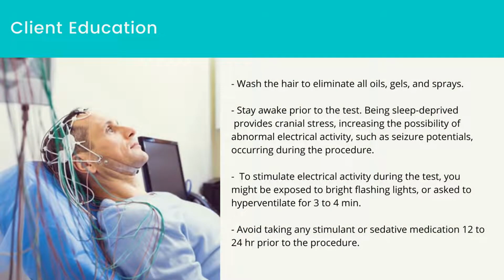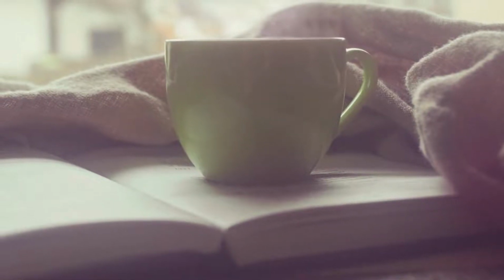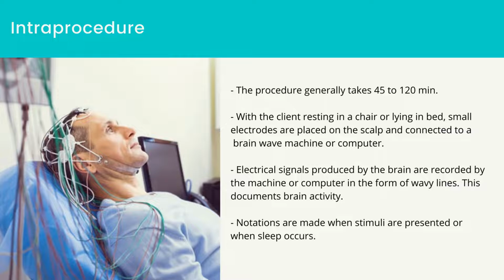Being sleep deprived provides cranial stress, increasing the possibility of abnormal electrical activity, such as seizure potentials, occurring during the procedure. To stimulate electrical activity during the test, you might be exposed to bright flashing lights or asked to hyperventilate for 3 to 4 minutes.